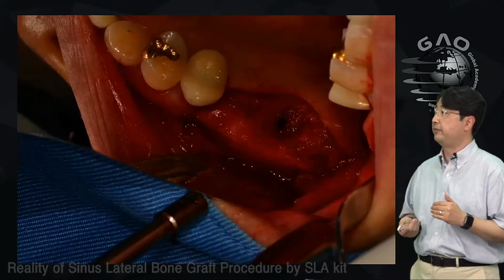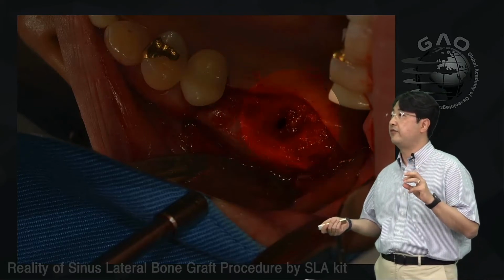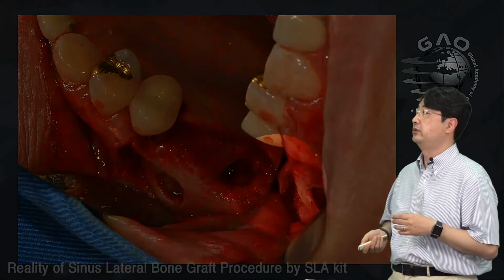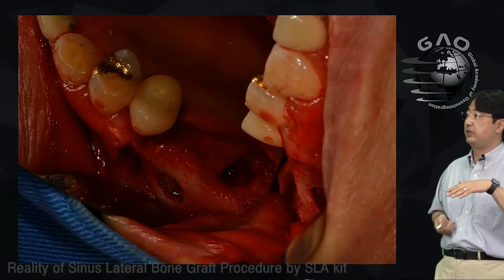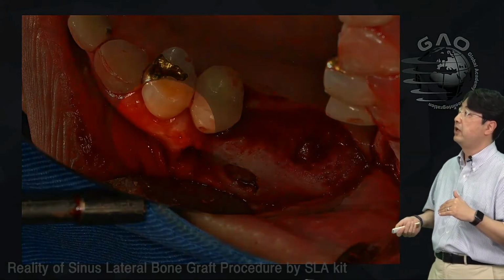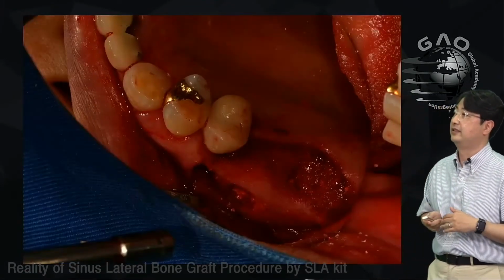When I opened the flap, I intentionally extended my incision to the palatal side, okay? So I found the opening, and I also found the perforation of the membrane. So now what are you going to do? What I did was I made a window on the area of number 26, and then I dissected the membrane, including the tearing part, right? I placed a collagen tape through the crestal opening on the number 27 area to cover the tearing part. Then I did the bone graft.